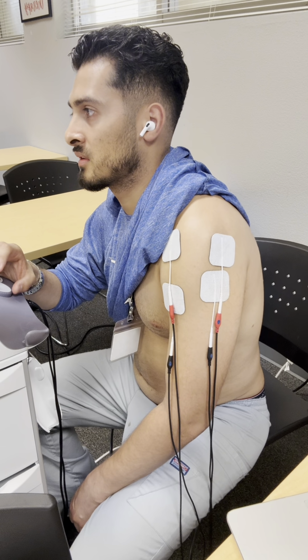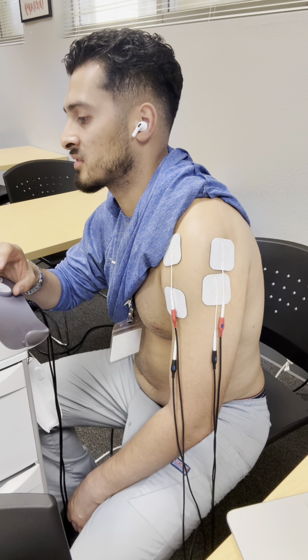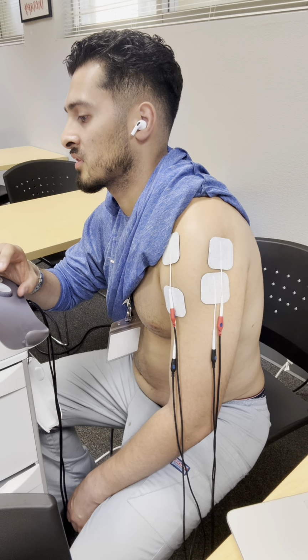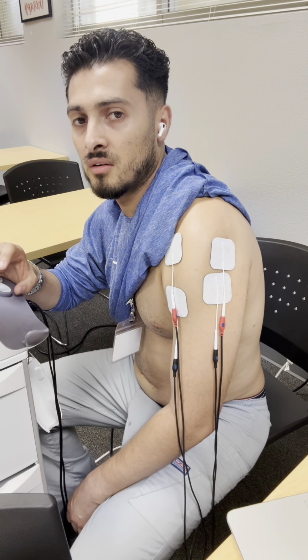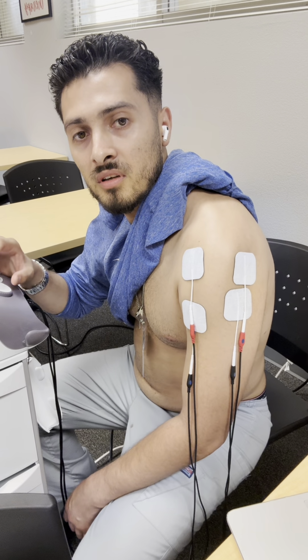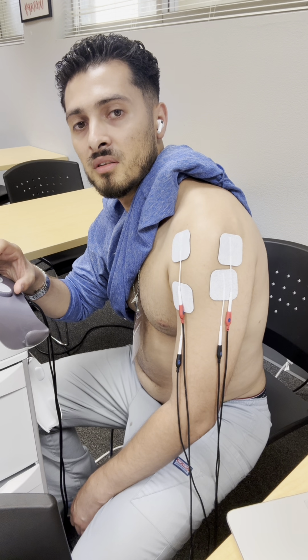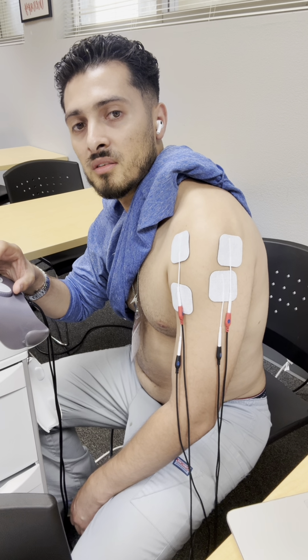There we go. And so that's just a constant buzzing sensation. Got it up to 9 now. If you can see there, got my deltoid buzzing like crazy. It's feeling pretty good.